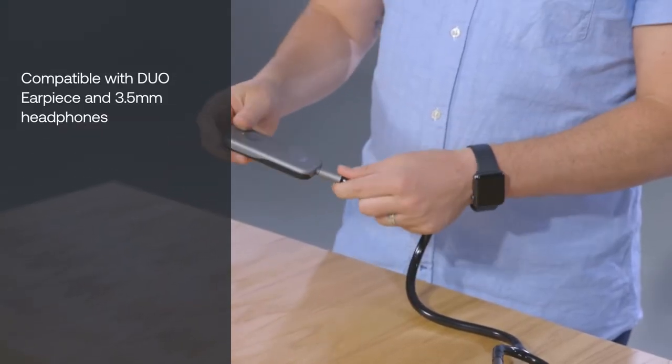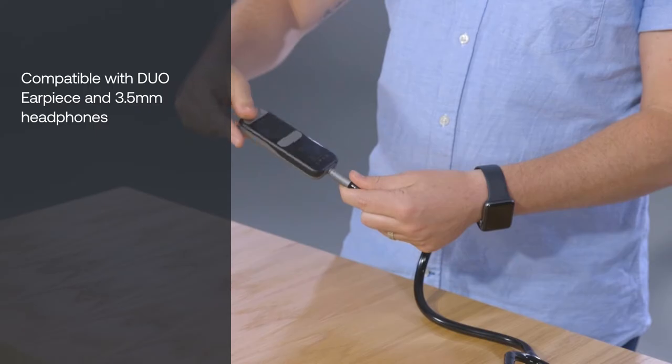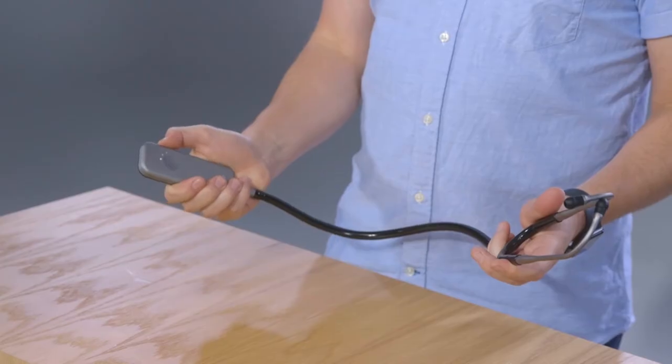If using wired earpieces for listening, attach them now. Adjust the volume to your desired level.